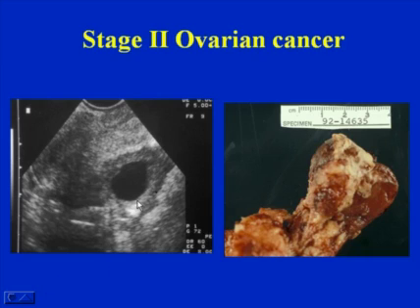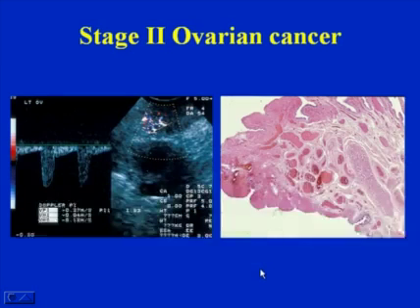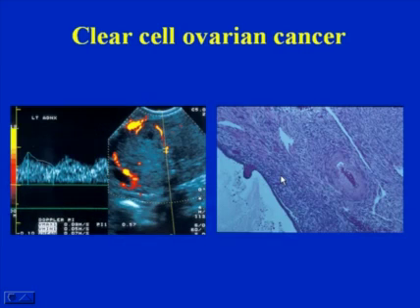Now, morphologically, this lesion has some suspicious characteristics. There's irregular wall thickening, there's an area of focal calcification, and in the wall itself we can see abnormal blood flow. This blood flow shows probably from vessels such as this that have no muscular media. Now, what was more concerning to me was the cluster of vessels right here surrounding the lesion, and these are associated with arterioles that are infiltrative in the fallopian tube in this ovarian cancer.